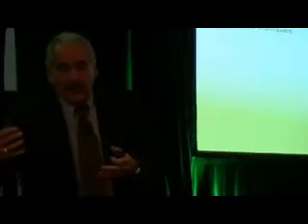And you'll be able to treat post-surgical failures, particularly if you combine it with manipulation, adjustments. So we have the best of both worlds. And I believe that we should embrace modern technology into chiropractic, but not lose the respect for the tried and seasoned true technology of adjustments, which have to always be done. So one helps the other. One is not in lieu of the other. Thank you very much. I really enjoyed it. Any questions?